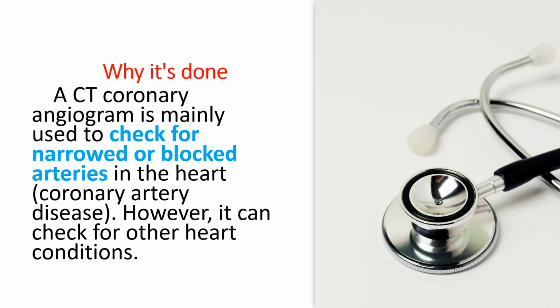So why are we doing it? Mainly we are doing it in order to check for narrowed or blocked arteries, so that we can measure how much they are narrowed or blocked and do further management.